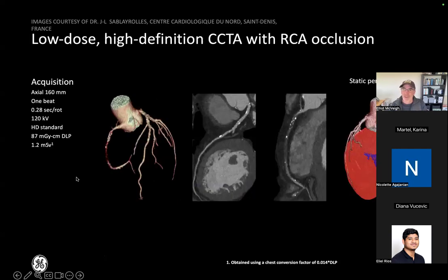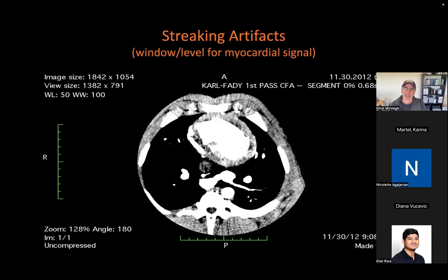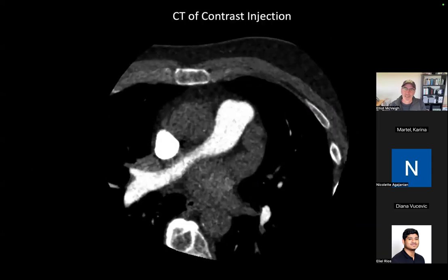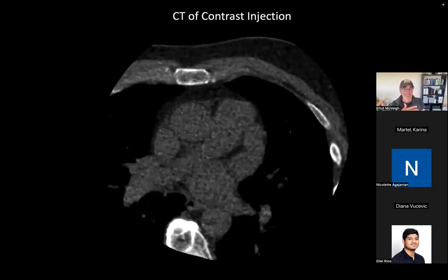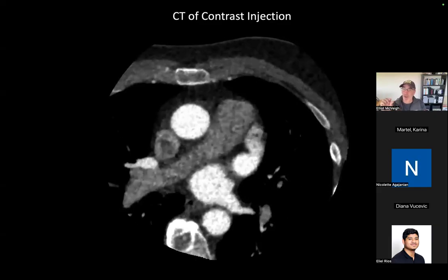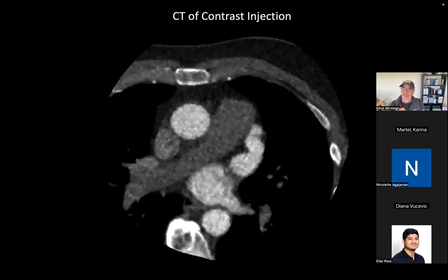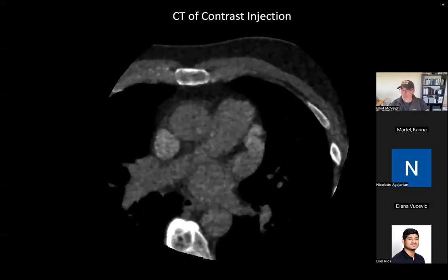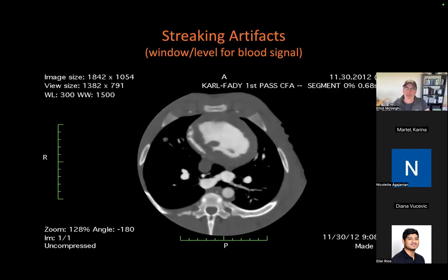Whereas doing perfusion, if we go back and ask, well, how much radiation do you need to do perfusion? If we go back to this acquisition here, that's over 40 seconds and it has 27 images, right? Each one of the images has very low radiation dose. And that's why the images look so grainy, because we're not using many photons. But we have to get time points in order to see these curves, right? So it's hard to really drop the dose a lot when you're doing perfusion.